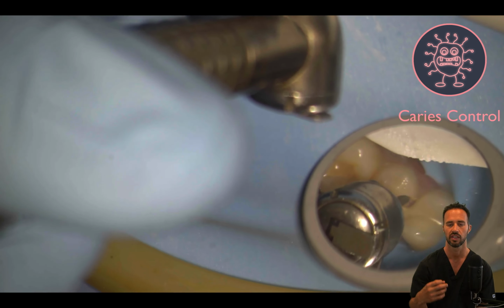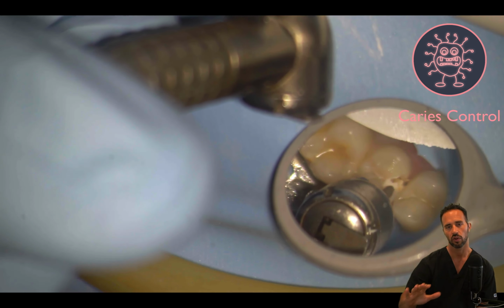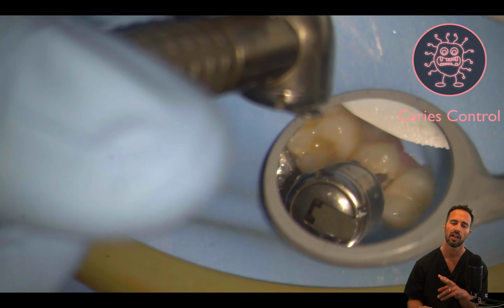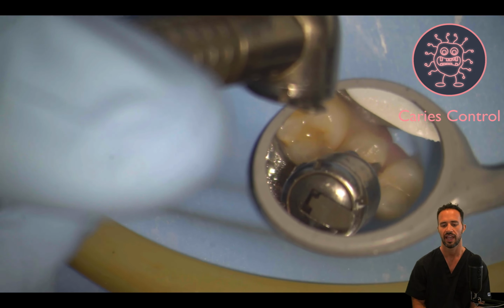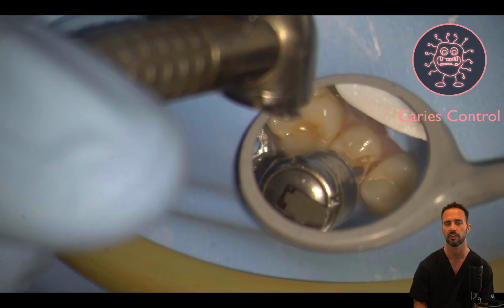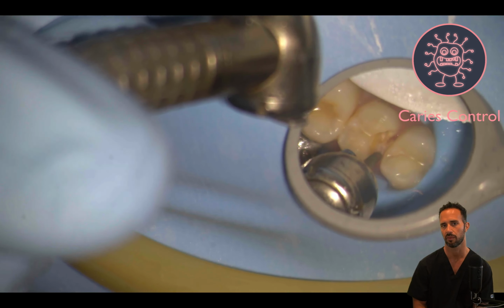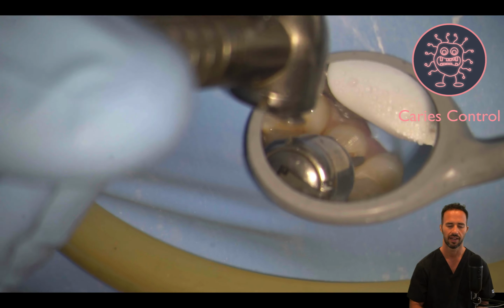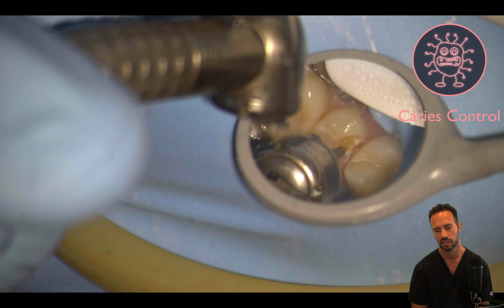our caries control. Now, like I mentioned before, lowering the occlusion is very important because it's going to give you stable reference points for your working lengths, and it's also going to reduce some of that post-operative pain that your patient may experience when they are recovering from their root canal procedure, right? So I don't need to go into detail about how to do caries control.